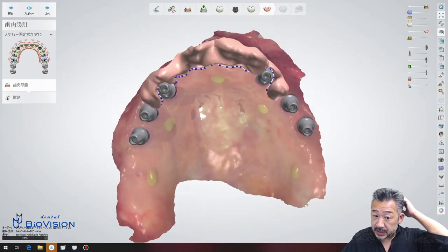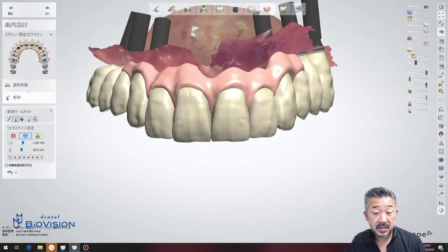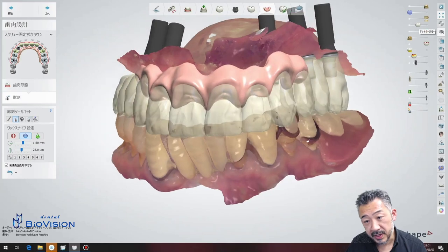As you can see, the realistic crown and gum design is complete.